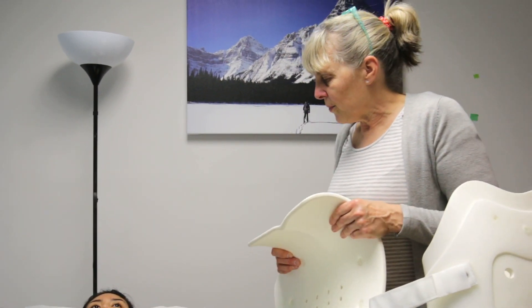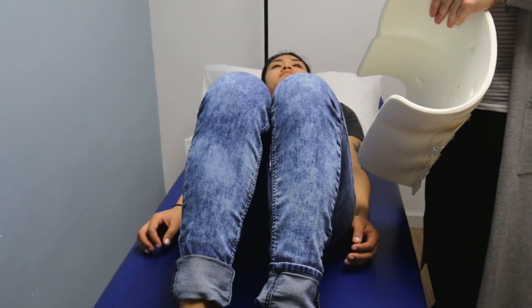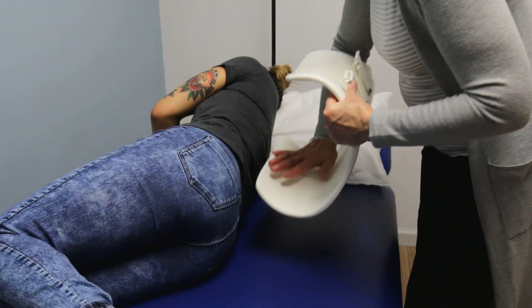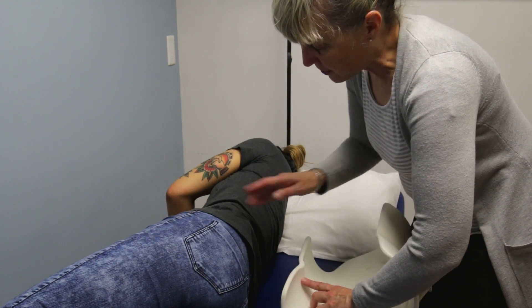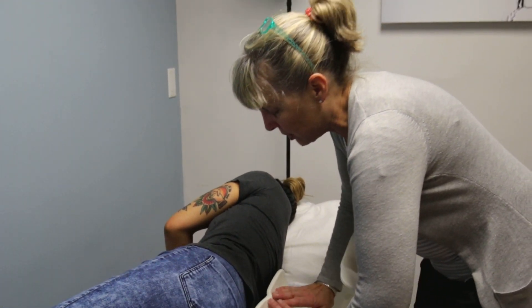So how we're going to put this on is we're going to have our patient bend their knees up and roll towards the wall. This is what you would do at home as well — a nice high roll makes it a lot easier. What we're trying to do is get the little waist divots to go right in where the waist is, so that we're getting the right location.